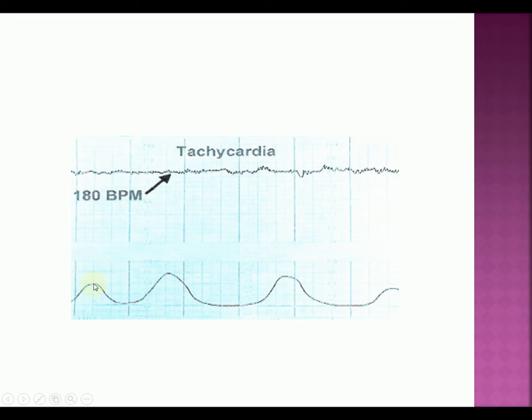So the peak of this one compared to the peak of this one, you can see they all have a little bit different peak. So if you were figuring up your Montevideo units, you would have to do each one of these separately. So this peak looks like it might be around 40. Resting tone, it looks like your resting tone is around 20, and this is not good. Or those may be 5. I'm not for sure how they have the monitor.